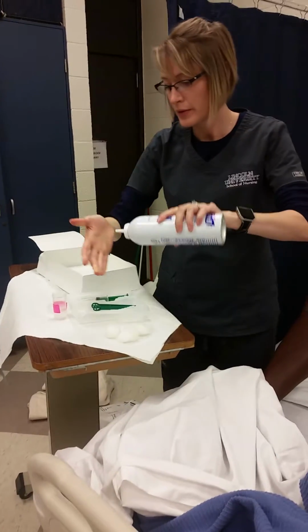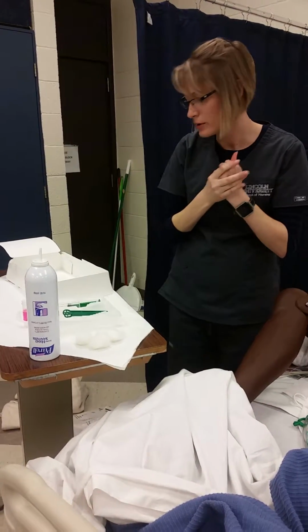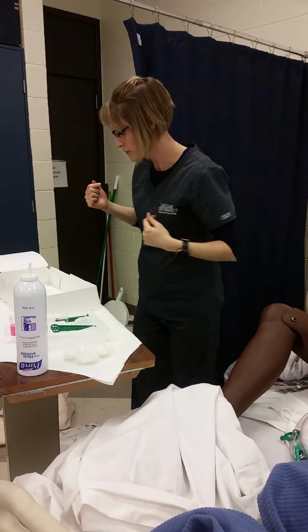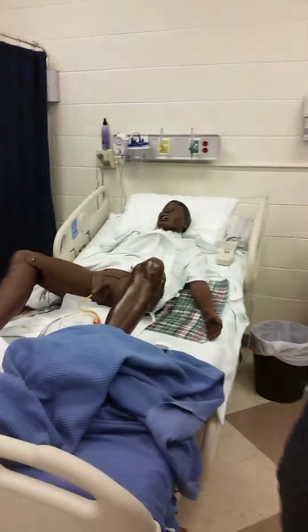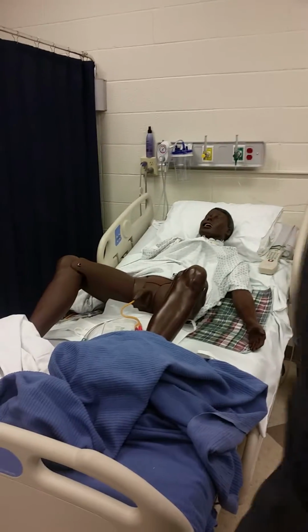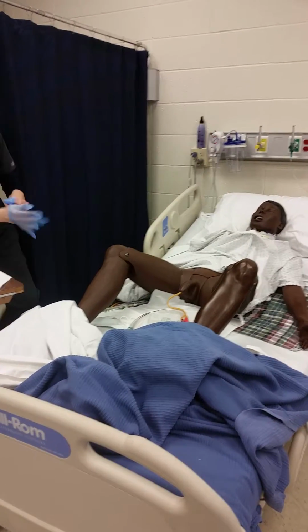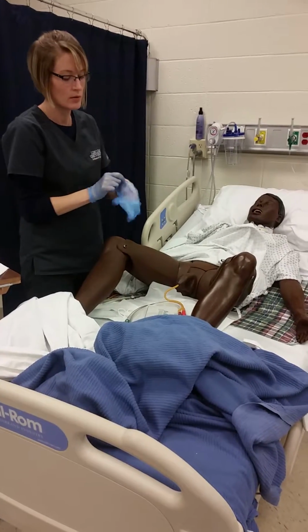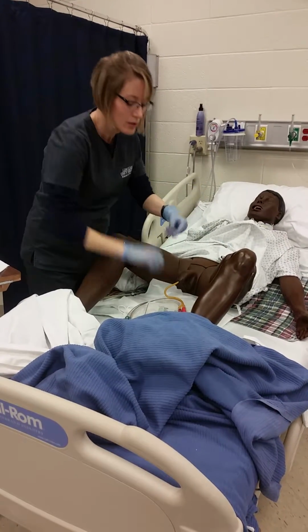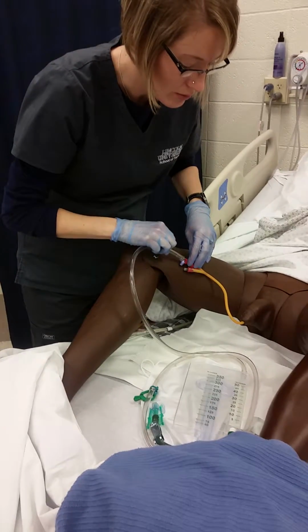I would wash my hands again. I'm going to go grab a set of clean gloves. I would grab another set of clean gloves. And I'm going to go ahead and secure this catheter to the patient's leg using a catheter securing device or just tape. So I would secure this to his leg, making sure that the ports are accessible.